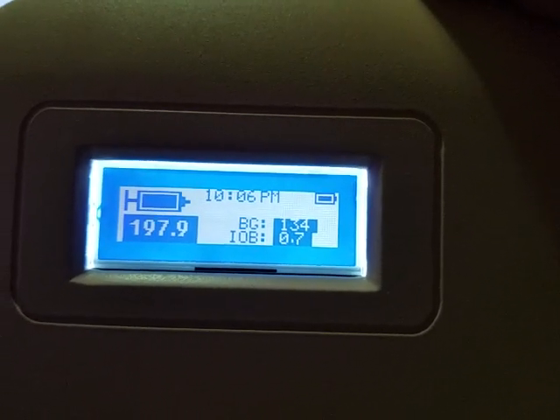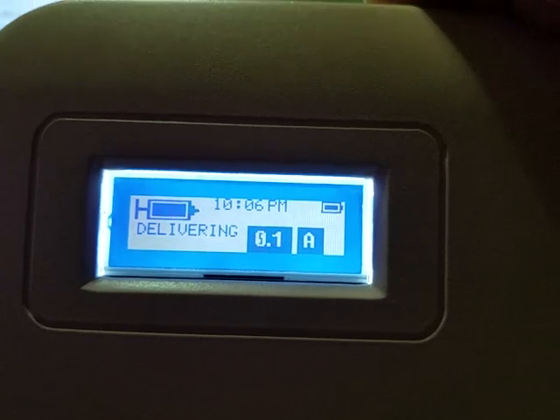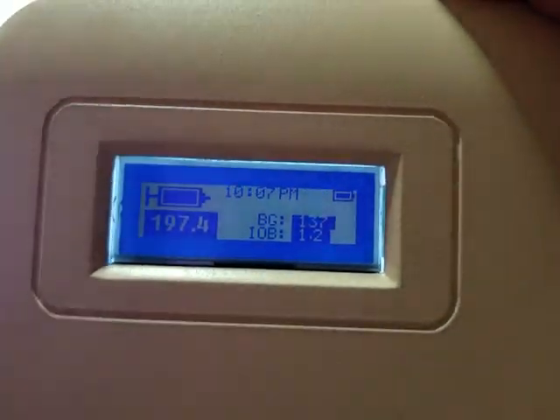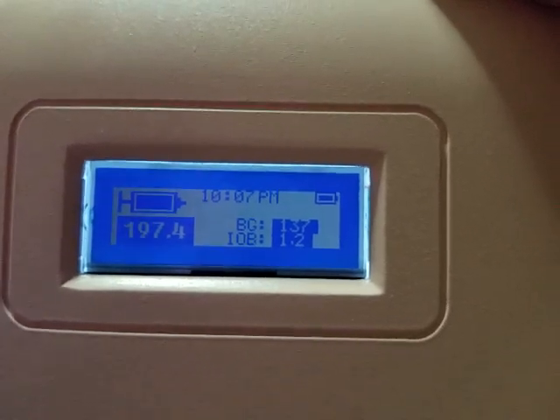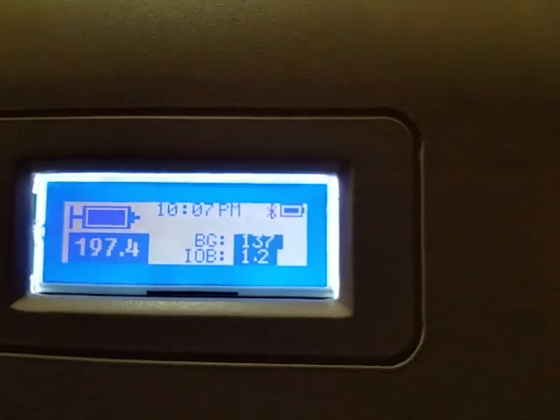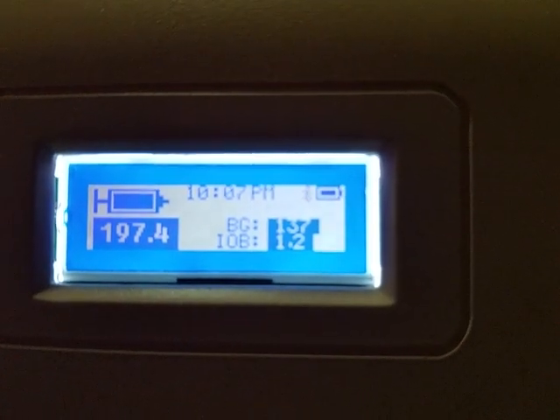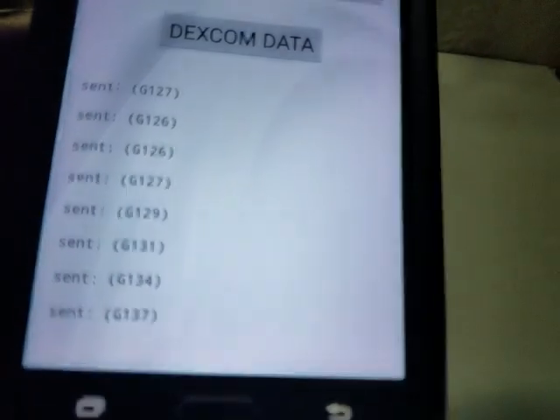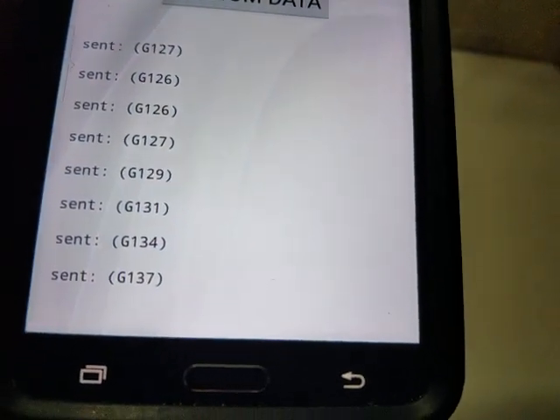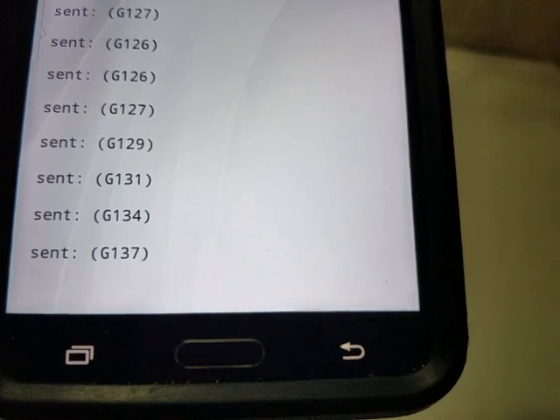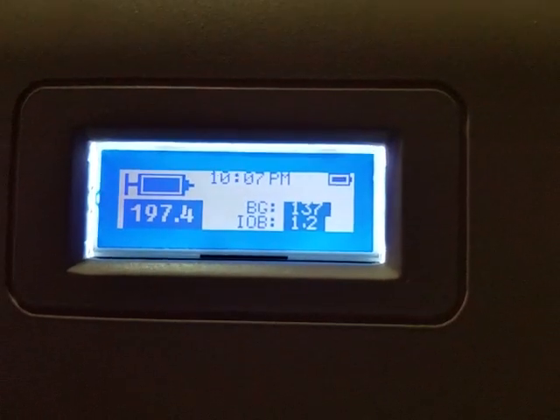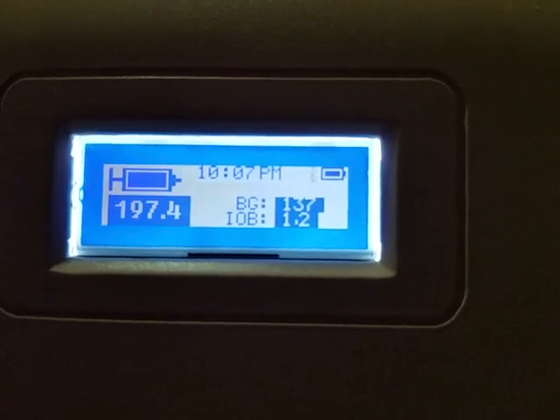There you go — wow, that was amazing! As we were watching, it gave us 0.5. Amazing timing. We just saw 0.5: the loop added insulin. That's because the reading is 137 and your limit is at 90. Your ISF is 38, and that adds up to almost 1.2. So this was pretty good — we just caught that right as we turned the camera on.